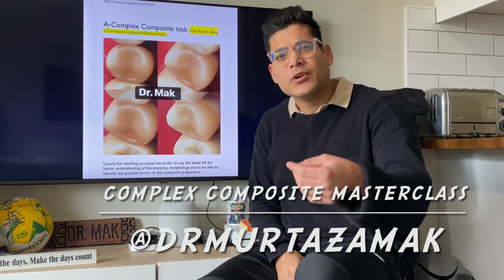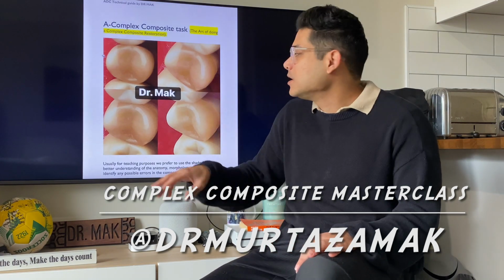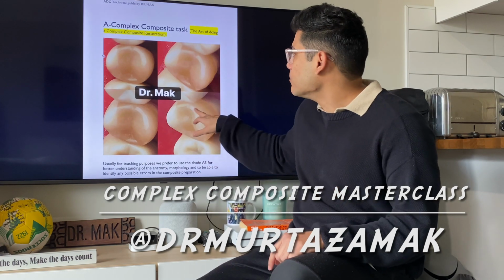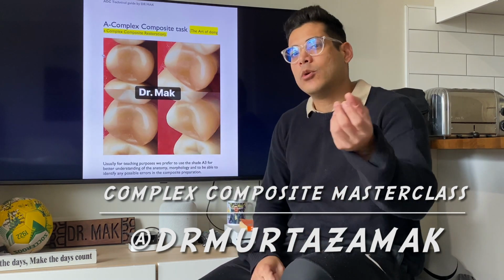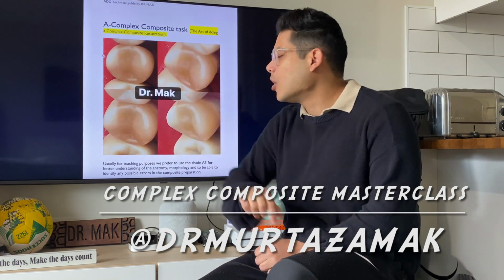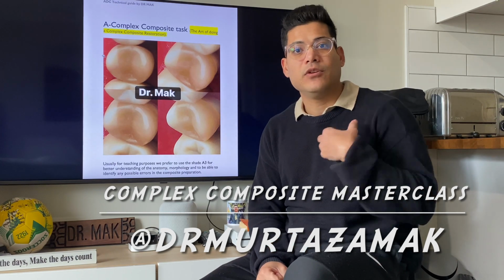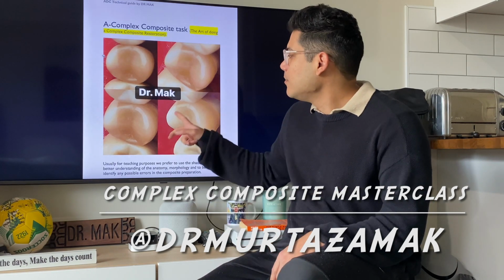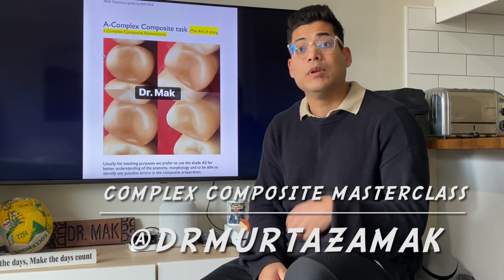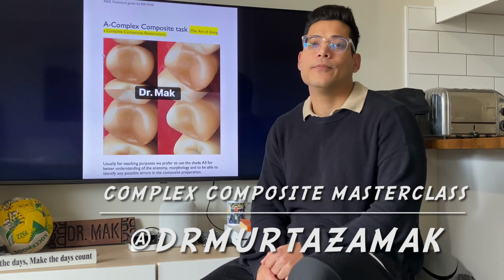Again, in the exam, you normally get A3 or A2 teaching teeth. When doing exams, they don't give you a tooth colored exact. They give you something a bit darker so they can easily tell what you have done, and it's easy to identify mistakes as well. If I do an A1 composite, it'll be hard to identify my mistakes. That is one of the other reasons why, when you are practicing at home, you should use a darker shade composite like an A3 or A4. You will be able to identify and correct your mistakes a lot better.